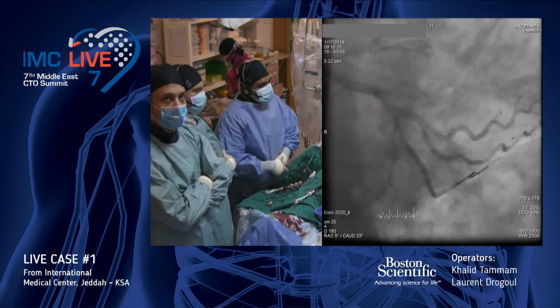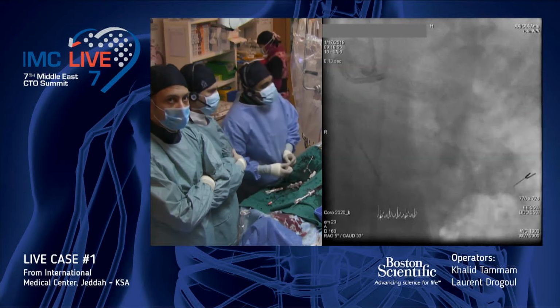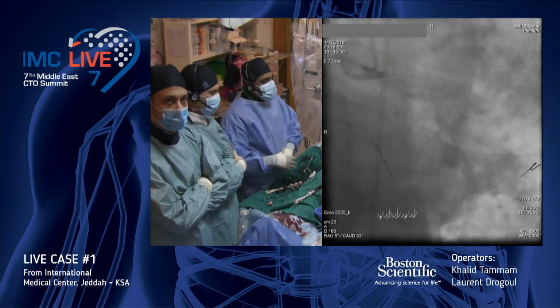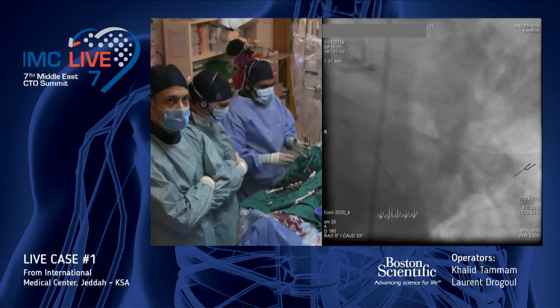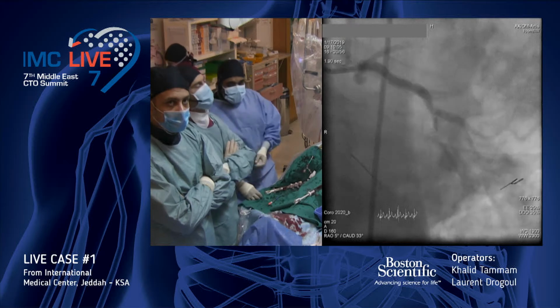So the circumflex now is fixed. It's good, so we can work more easily in the LAD part. So I will let you discuss the strategy. We are here now, Alexander. You start to discuss with the audience what your strategy is, and then we'll tell you what we'll do.